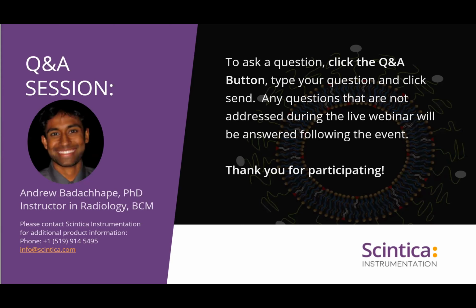What is the optimal time point for imaging post-injection of the liposomal gadolinium? We often try to image within an hour. I was just talking about throughput for our non-contrast applications. For contrast applications, since we are doing tail vein injections, which do require a certain amount of expertise, which thankfully we have in several people in our lab who are very good at it.